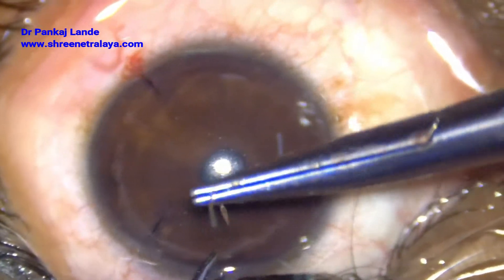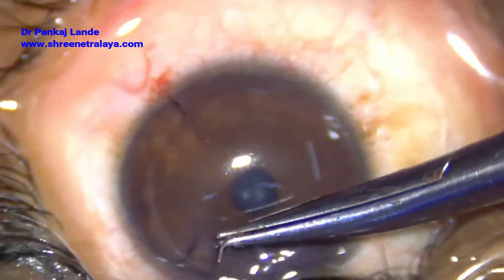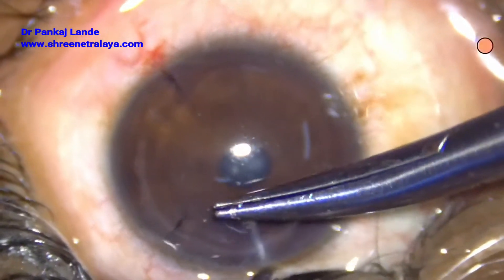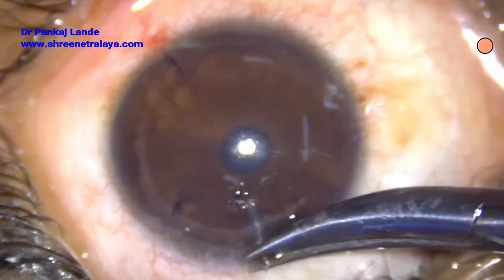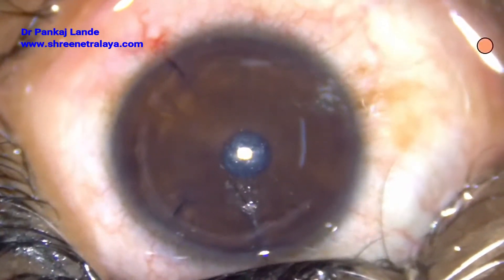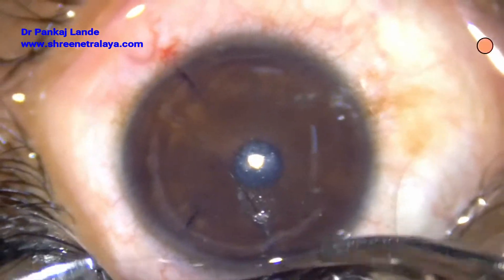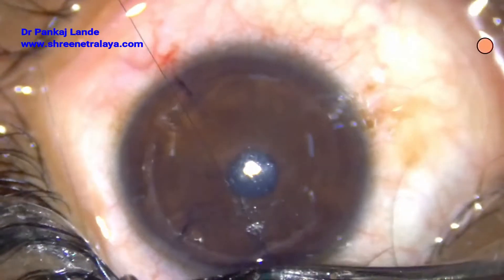The knots of the sutures should be buried away from the flap. Once the flap is well secured, place a bandage contact lens for the next 24 to 48 hours and observe the patient. Mitomycin C can be used if there are chances for epithelial ingrowth.